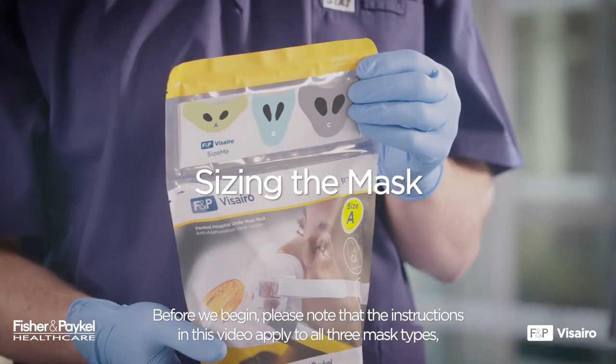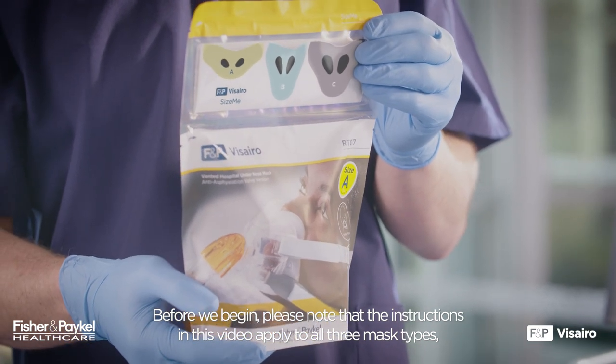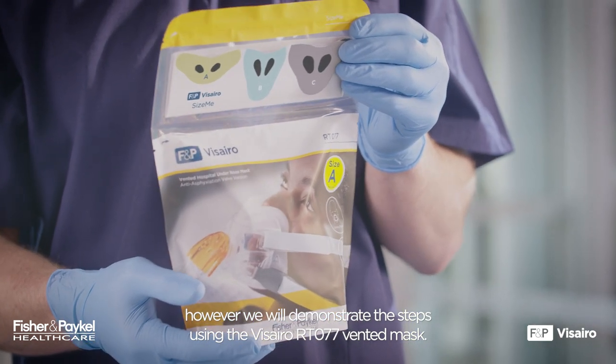Sizing the Mask. Before we begin, please note that the instructions in this video apply to all three mask types. However, we will demonstrate the steps using the Vizzero RT-077 Vented Mask.